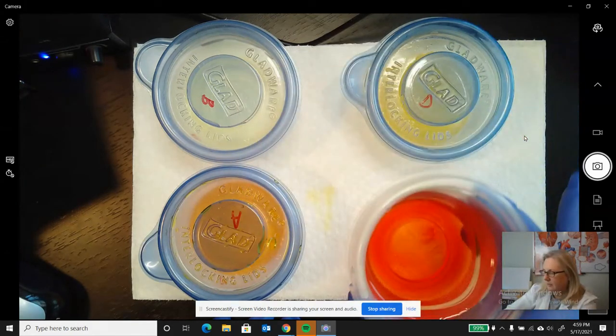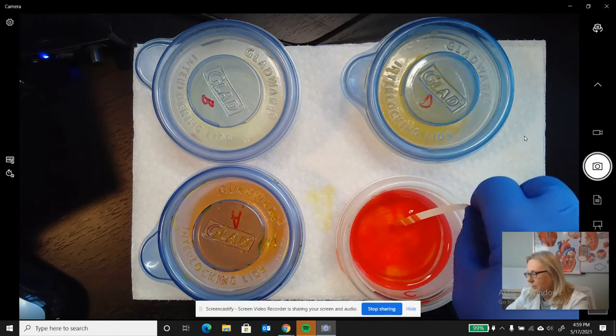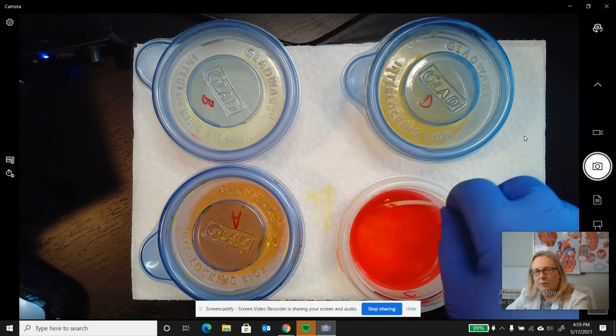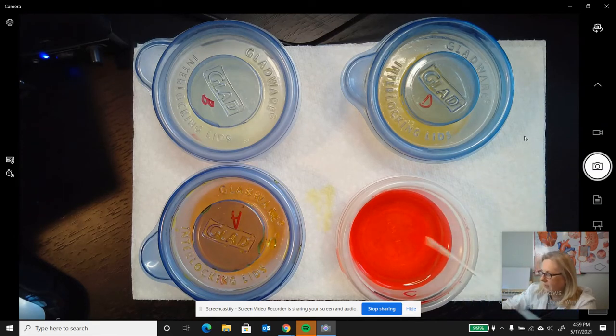All right. Next up is pH. Let's get a fresh pH strip and we'll dip it in. See what we get. Oh my goodness. Did you see what happened when I did that? Look at when I stir it up. Look at the stuff floating in it. Ooh, there's stuff going on in there. Okay. Something happened to this for sure. Holy moly. Let's find out what's going on with this pH.